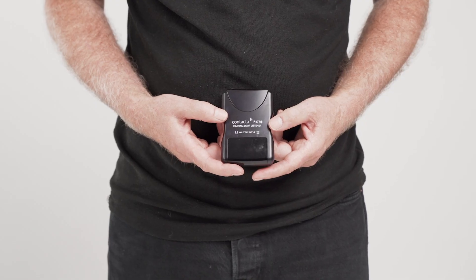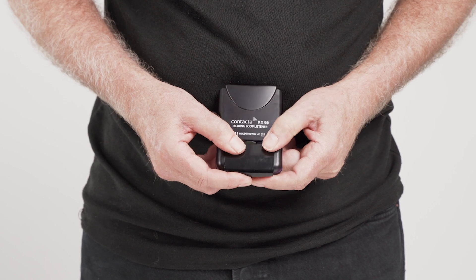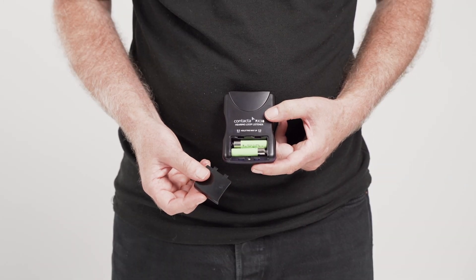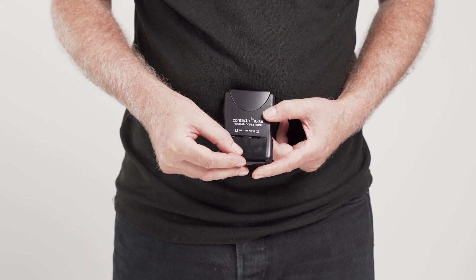The RX30 is powered by two rechargeable batteries. The battery compartment opens by sliding the cover in the direction of the arrow. Insert the batteries inside ensuring the correct polarity is adhered to, replacing the cover once done.